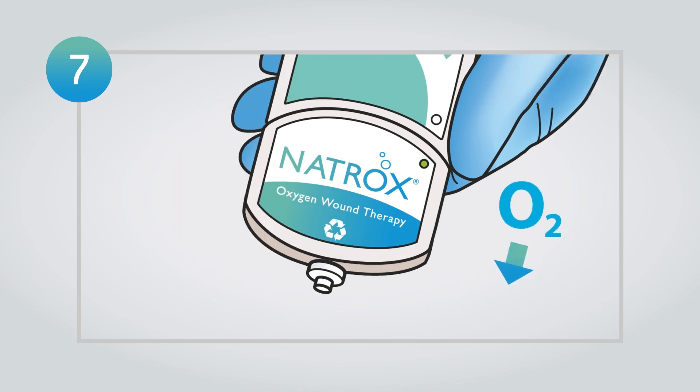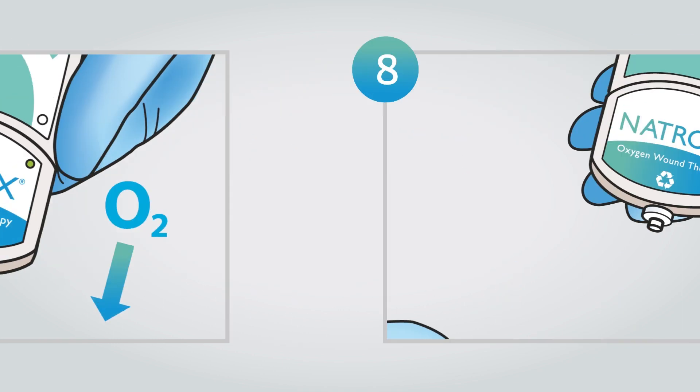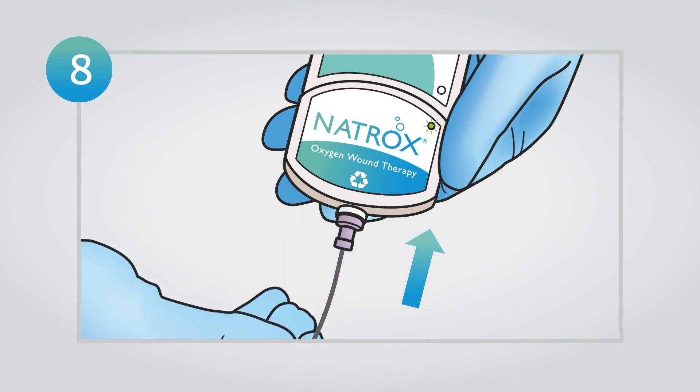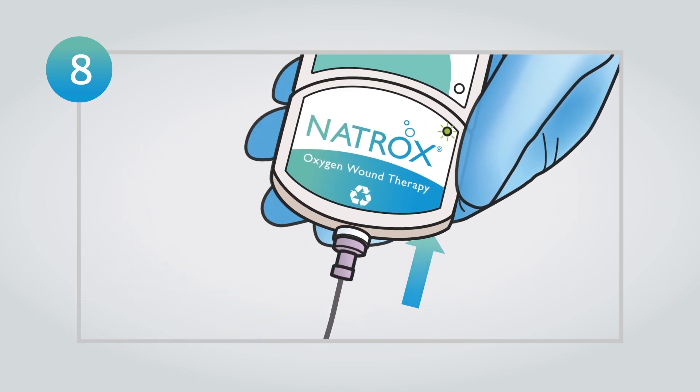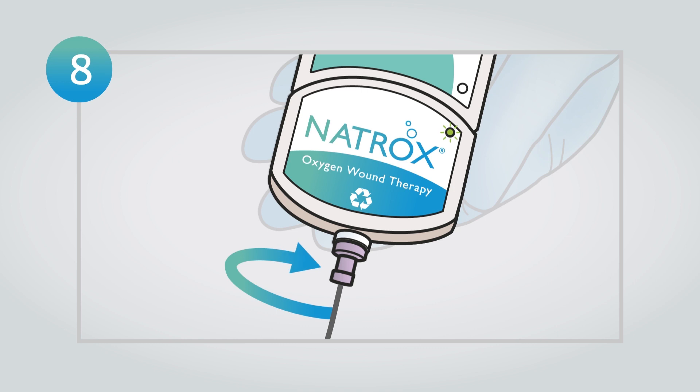This indicates oxygen is now flowing. Connect the ODS to the OG using the twist and lock connector. Be careful not to over-tighten.